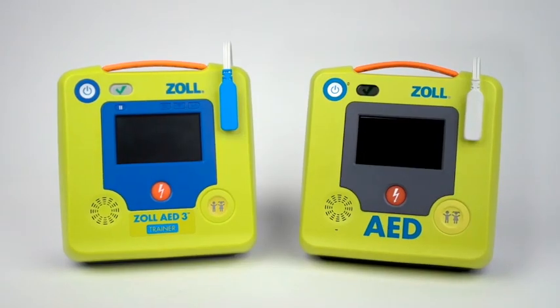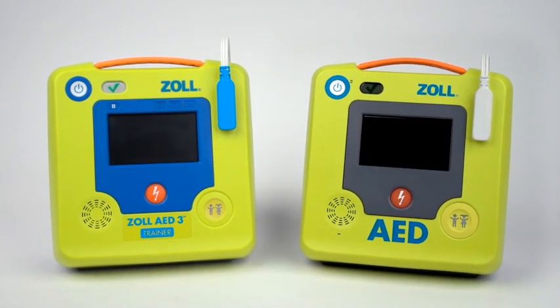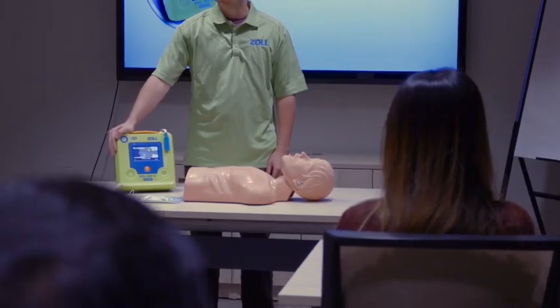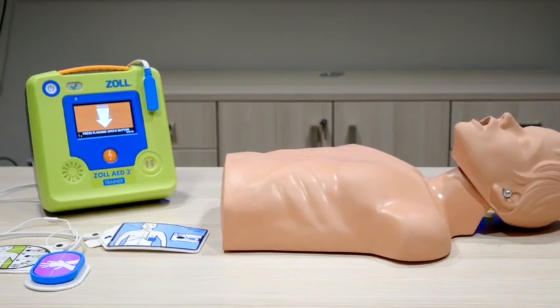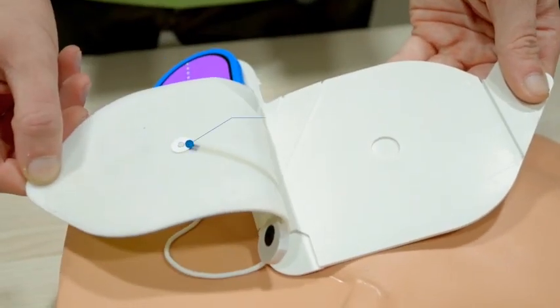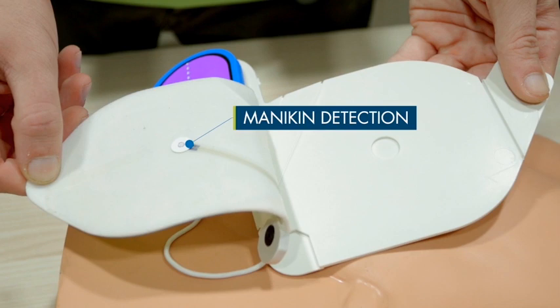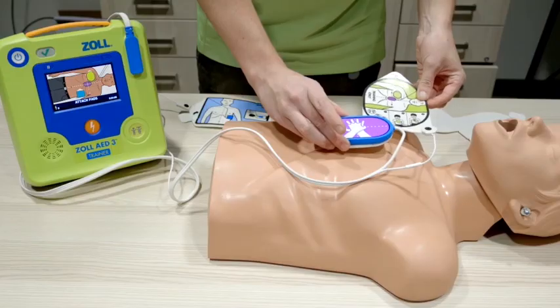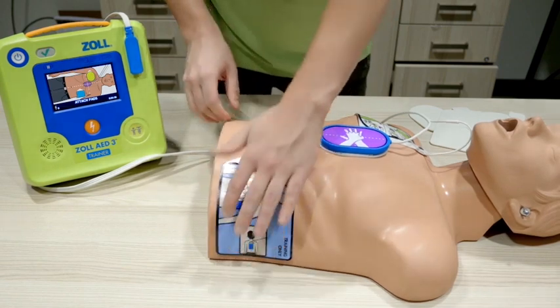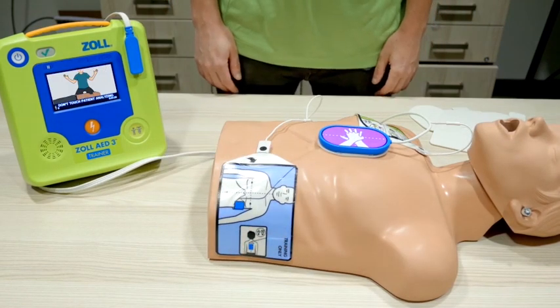The Zoll AED-3 trainer is designed to closely mirror the design of the clinical Zoll AED-3, allowing for a realistic training experience. The Zoll AED-3 trainer is designed with pads-on-mannequin detection. Once the trainee places electrodes on the mannequin, the Zoll AED-3 trainer will recognize this and move to analysis.